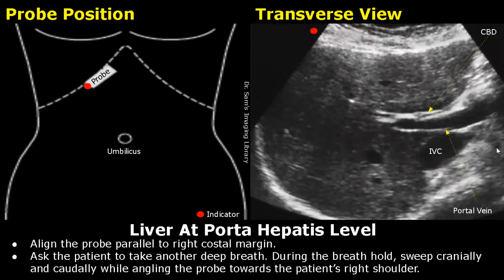Aligning the probe in a similar manner, ask the patient to take another deep breath and sweep up and down while angling the probe towards the patient's right shoulder, and you will locate the porta hepatis. This is the liver in transverse view at the level of porta hepatis. Here is the portal vein and the CBD anterior to it. The inferior vena cava is seen in cross section.